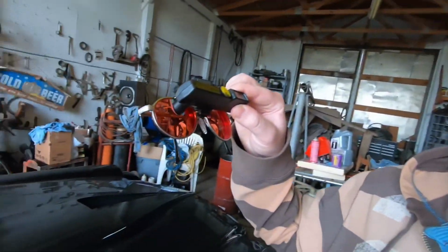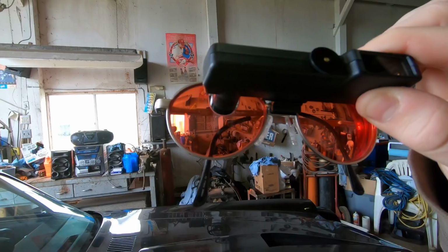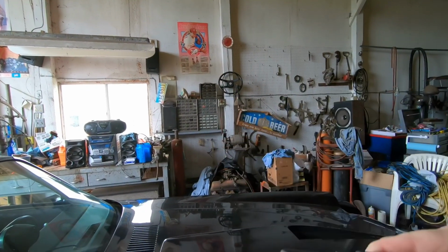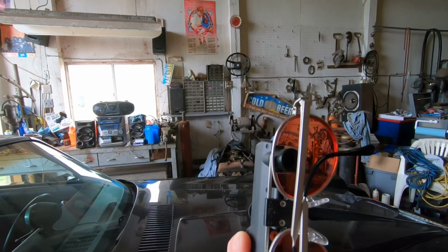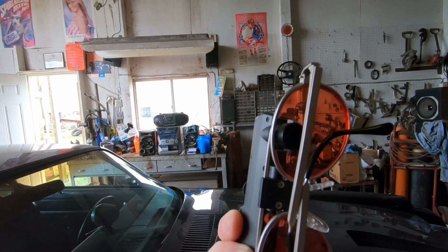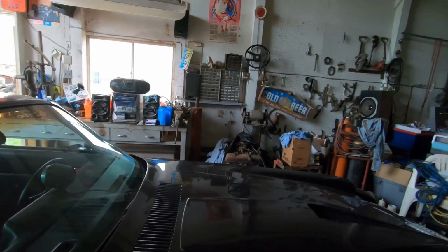I don't know how easy it's going to be. I don't know if you can see that on camera. Like I said, I'll take pictures. But there's a good gap right there where there doesn't need to be a gap. That could be lens right there. Even, I'm sure if the telescope touched the lens, it wouldn't be that big of a deal, because it's not going to scratch the lens, per se. And on the other side, you can see a big gap right there, and that's right in the middle of my eye. So the best analogy I could think of is like when you're, set these down carefully.